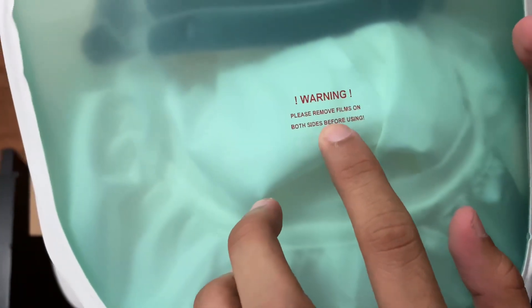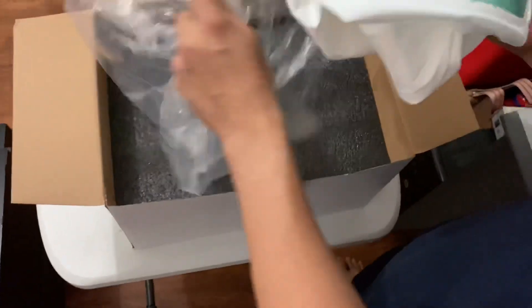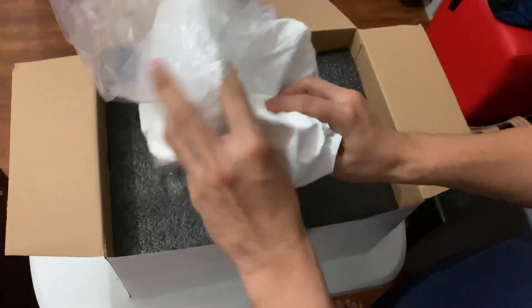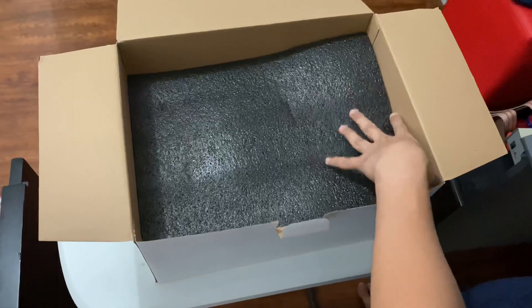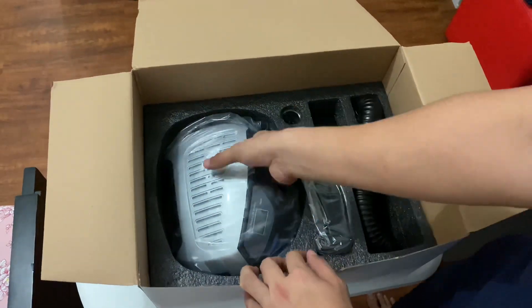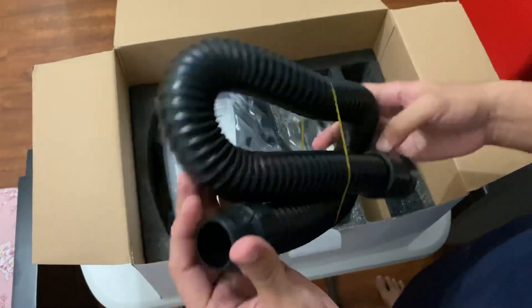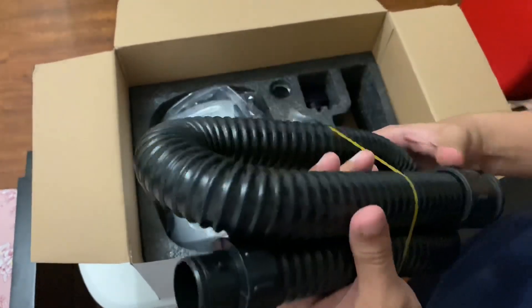Then, this is the hood. Remove films on both sides. I guess this one is a clear plastic, once you remove the film. Then, inside you can see the tubing that connects the respirator unit to the hood.